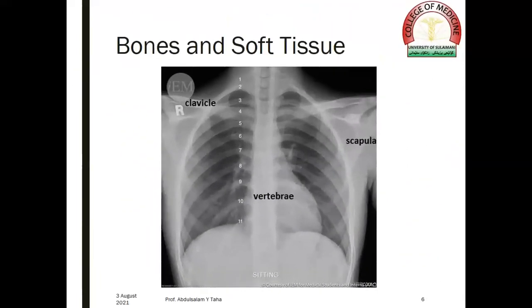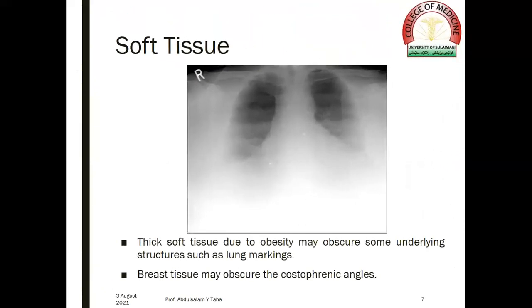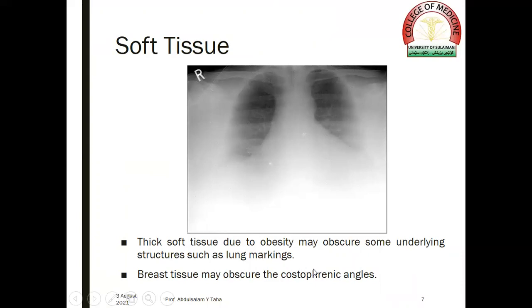Bones and soft tissue. We should be able to see the clavicles, the scapulae, the vertebrae, and the ribs — the posterior and anterior ends of the ribs. Thick soft tissue due to obesity may obscure some underlying structures such as lung markings. Breast tissue may obscure the costal phrenic angles, like in this slide.